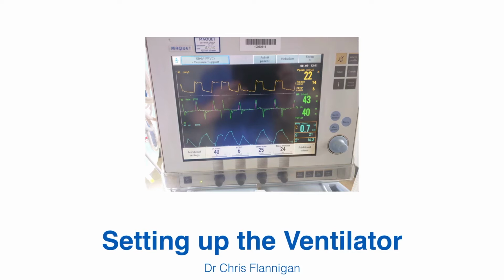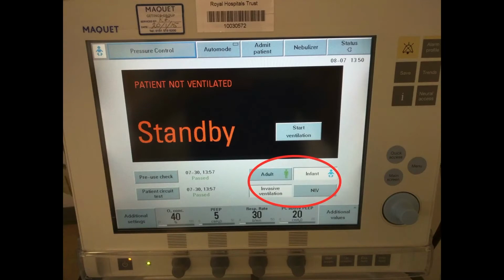I'll talk a little bit more about both of those later as we go through the individual settings on the ventilator. So you can see it's not quite as complicated as you maybe would have thought at the start. It's simply a box that blows air into your patient, and how it does it depends on which of the settings you've selected. So I'm going to go on now and talk about how to set up the Servo-i ventilator for the first time, and some of the settings and modes of ventilation, and hopefully things will become a bit clearer as we go along.